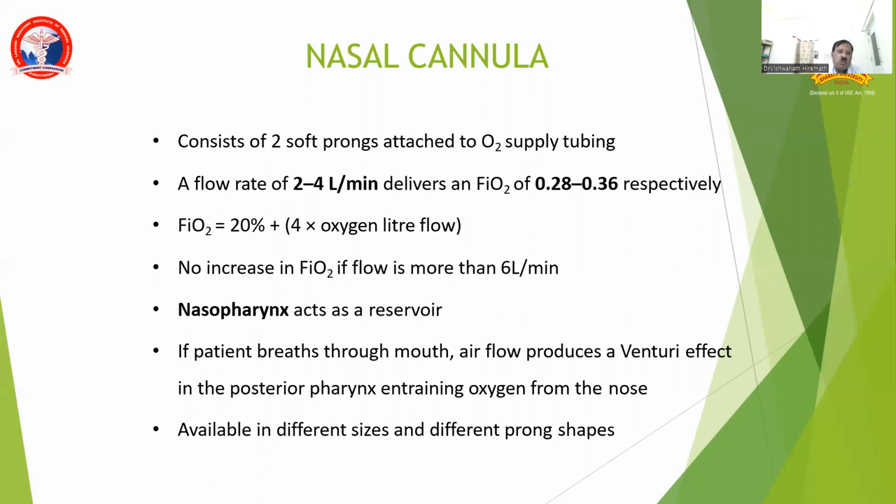A flow rate of 2 to 4 liters per minute is usually delivered to attain an FiO2 of 28 to 36, or 0.28 to 0.36. 1 means 100%. FiO2 attained is equal to the room air plus 4 times the oxygen delivered in liters.